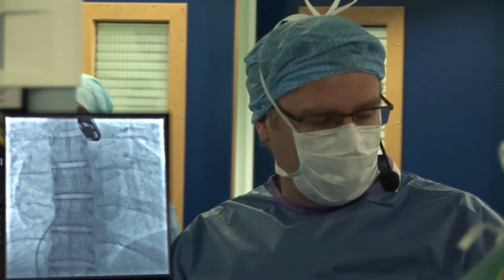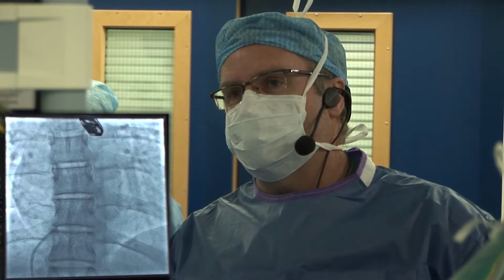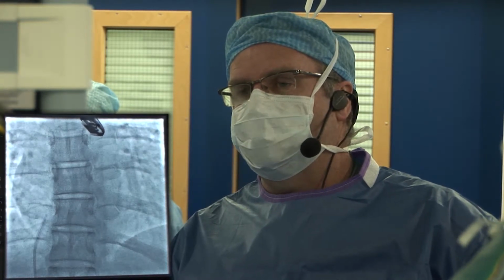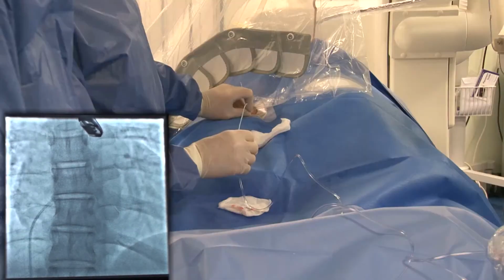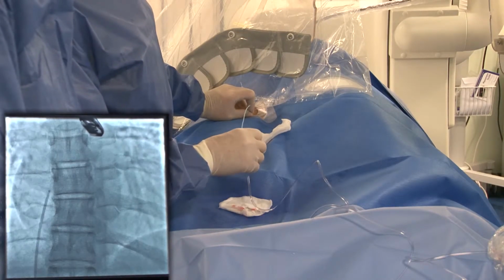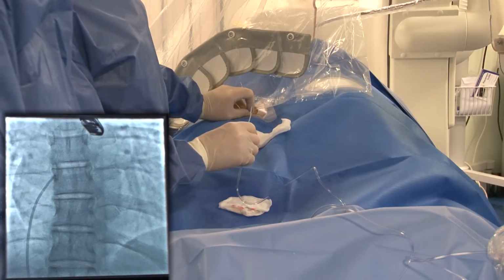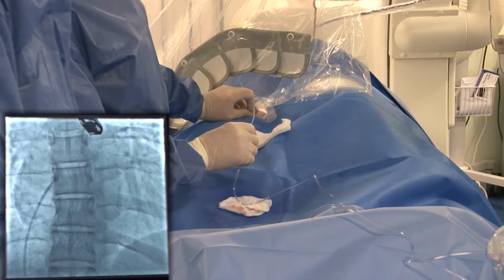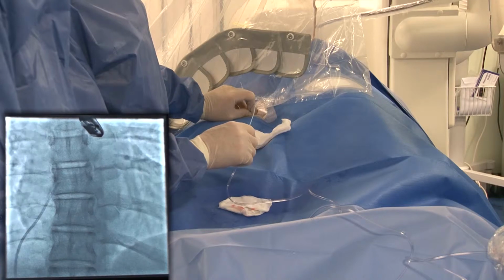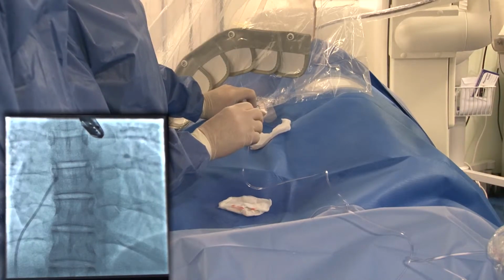To cross the PFO, we use the same multi-purpose catheter, and what we need to do is start at the lower part of the atrial septum and just angle the catheter posteriorly like that, and then just gradually come up the atrial septum, keeping it angled posteriorly. As I showed you, there's quite a long tunnel here, so the secret is just to wiggle the catheter through the tunnel. That's the tip of it catching in the tunnel just now, I think. Yeah. Nilesh might be able to see it. At this point, the secret is not to push it on, but just to rotate it slightly and wiggle it through, and it finds its own way through.